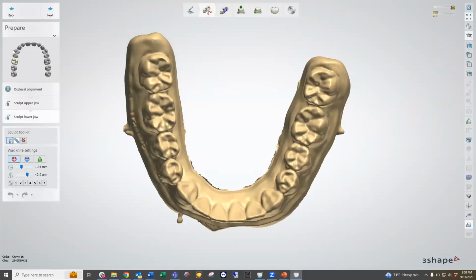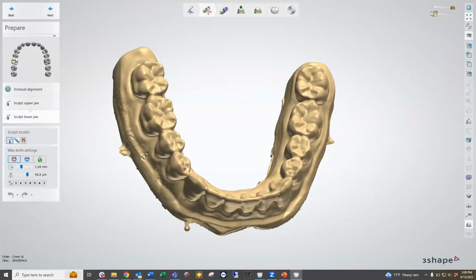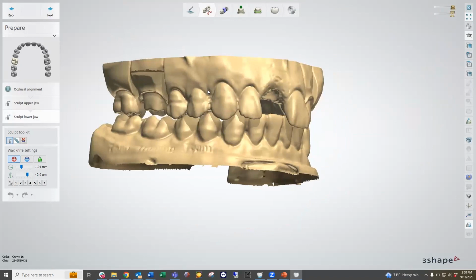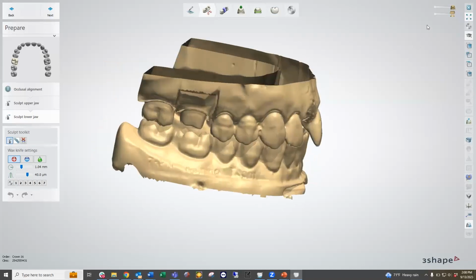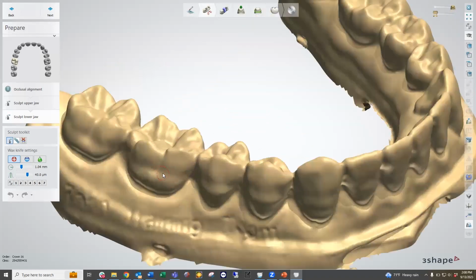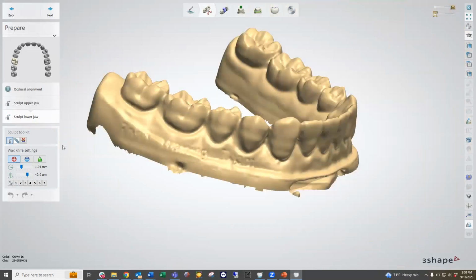Now, since this one we're looking at tooth number 3 over here, we're going to go ahead and look at the opposite side because that's going to be the opposing. And I can actually turn on my other jaw to see where we're hitting over here. And I'm just going to look at that opposing area to see if there's any interruptions in that model as well. So again, we're utilizing our sliders that we have in our upper viewport over here and just seeing if there's anything that needs correction at this time. And that's simply what the prepare step does.